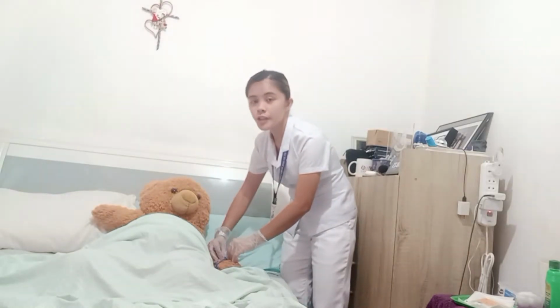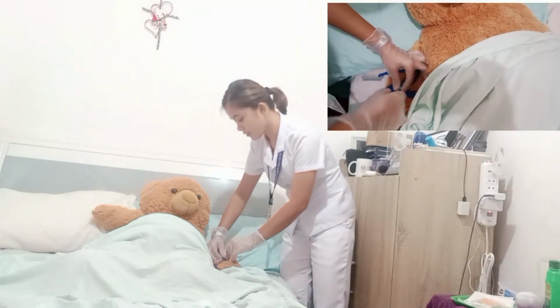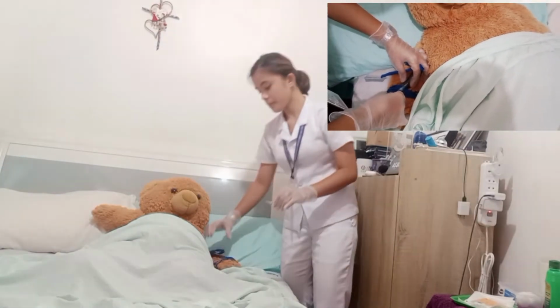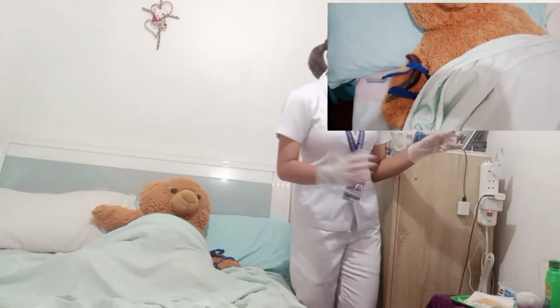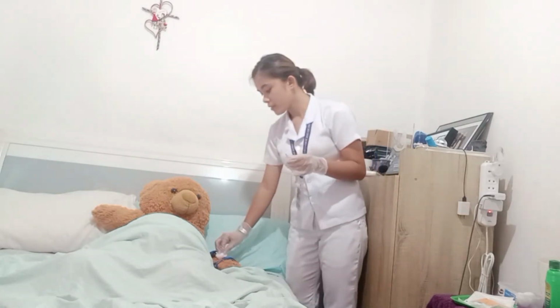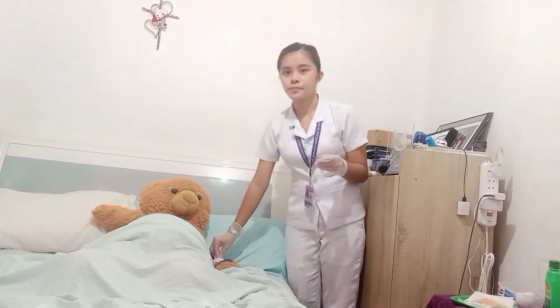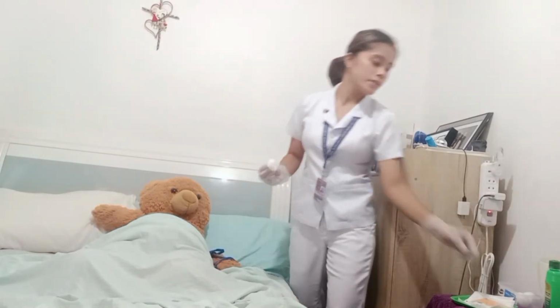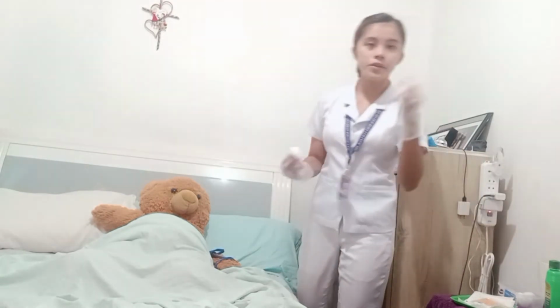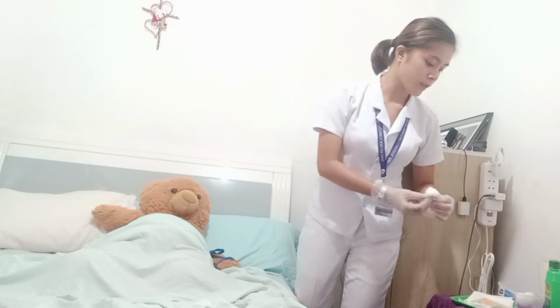So now withdraw the needle at the same angle that it was inserted. Then pat the site using a dry cotton ball and don't massage to minimize tissue damage and discomfort to the patient. Now encircle the wheal. I will dispose of this in the waste receptacle.